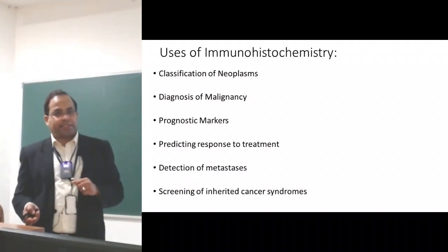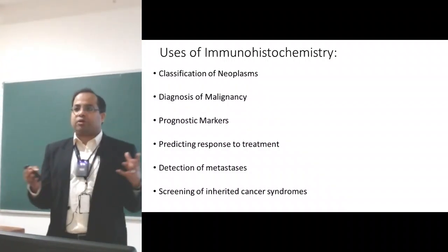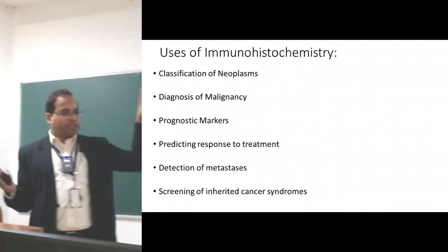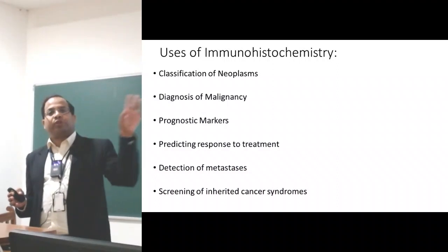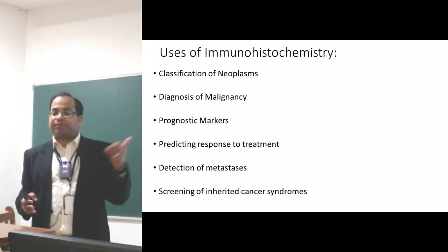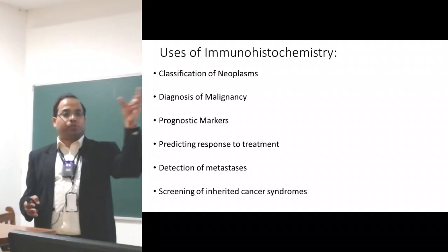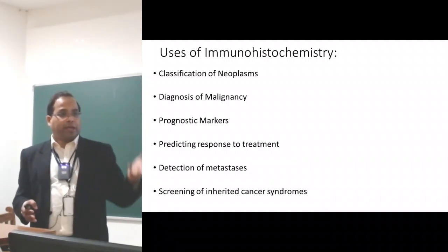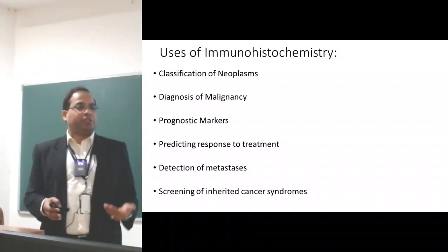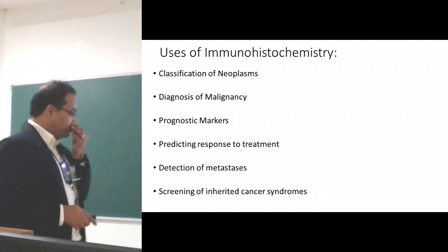Detection of metastasis. For a specimen of the head and neck, a breast, or a colon, we might have to look at 30 to 40 slides before constructing the report that I showed you. There were 27 out of 34 lymph nodes here. It is a very tedious task for the pathologist to look at 30 sections to find 1, 2, 3 or maybe more metastases. So immunohistochemistry and computational pathology can help us in detection of the metastasis much quicker.